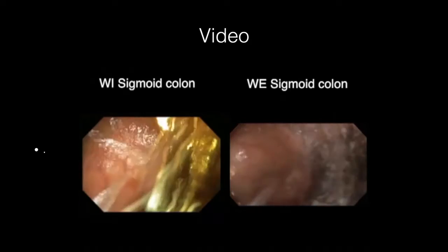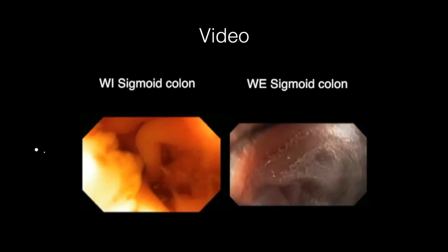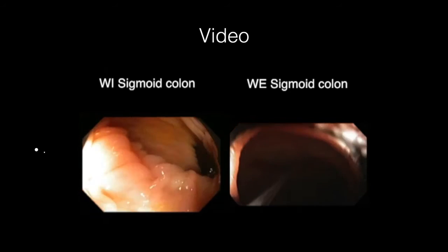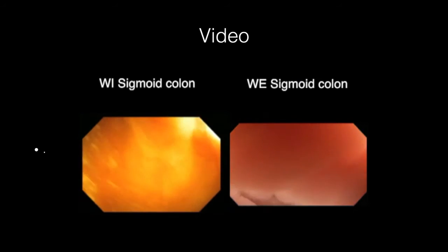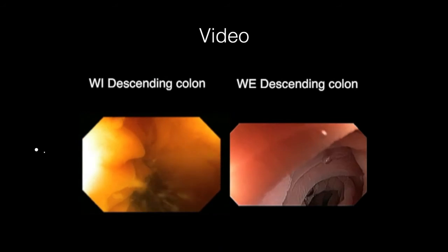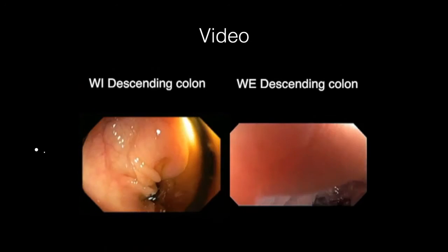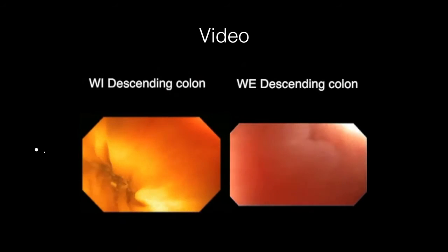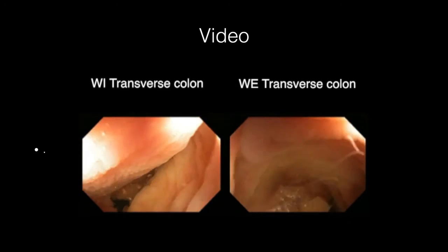We put together a sequence of video clips in both techniques. On the left side is water immersion and on the right side is water exchange. In both techniques water is infused. The difference is that in water immersion, water is infused but residual colon prep and air pockets are not aspirated — bypassed to speed up cecal intubation. But in water exchange on the right-hand side, water is infused and suction is carried out at the same time, substituting all colon content with a layer of clear water, allowing instrument progression to the cecum, maximizing cleanliness and minimizing distention.